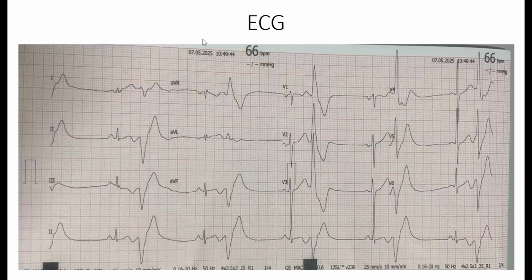Second point is, because of the lack of MRI, you did a 3D mapping. If there was any voltage abnormality in your LV map, when you did the 3D mapping in this case, Sokan, you would have created a map there. Have you looked at any scar tissue, substrate?